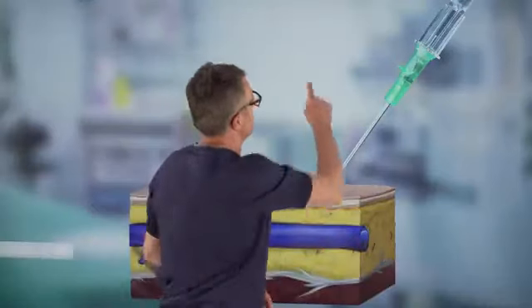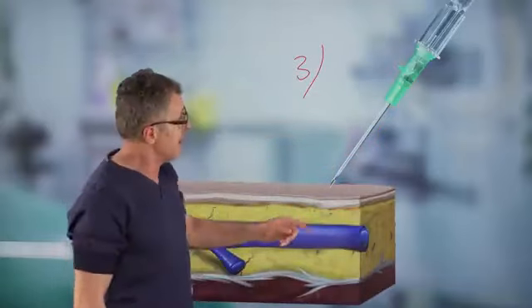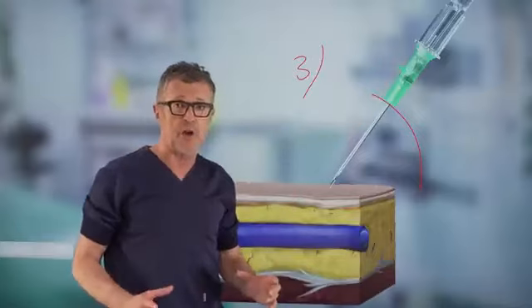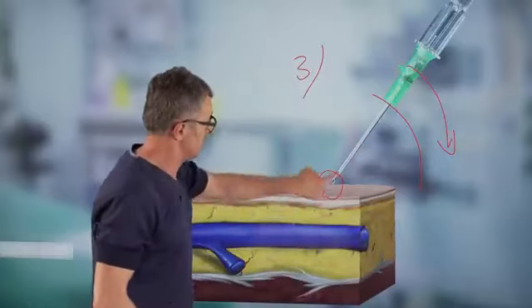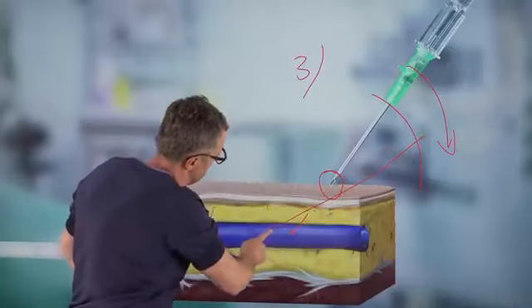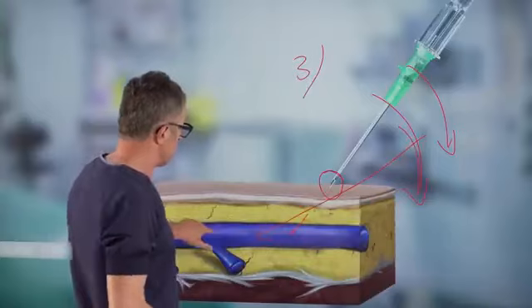Mistake number 3. In this situation, we can see the needle catheter system aiming towards the peripheral vein, but here you can see how this angle of insertion is rather large. When you have an angle of insertion that is so large, it is really difficult to compensate for it eventually when the needle enters the vein. It simply is too tenuous. You really need to enter at a much lower angle to have more slack to be able to readjust the needle angle one more time and feed the needle catheter system deeper.